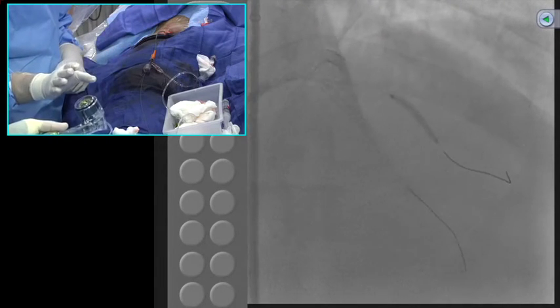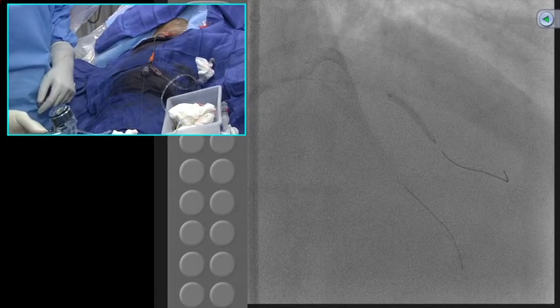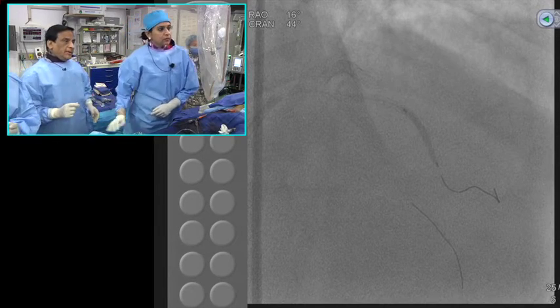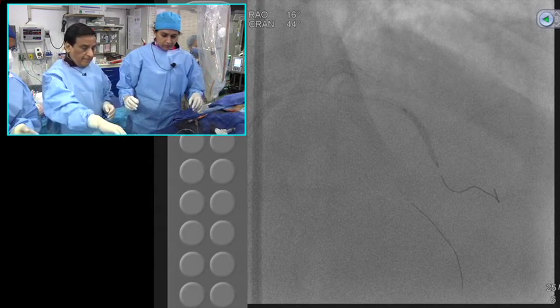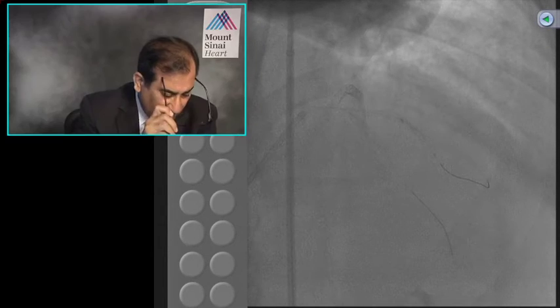And it's a 14 French. So that's remarkable. You need only a 14 French device, so it's a great addition. Big advancement, yeah. And I know that Sapien 3 is available, but that may not be truly 14 French. But the key is that Evolut R is definitely a 14 French. Look, in 2 or 3 years to have gone from 22 French to 14 French. Amazing. Unbelievable.